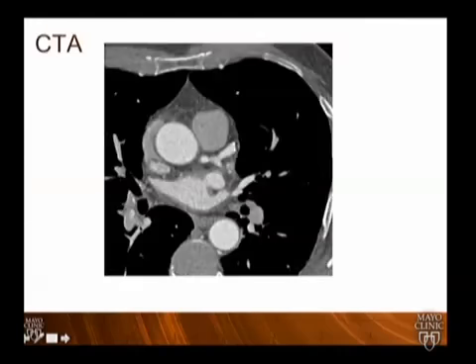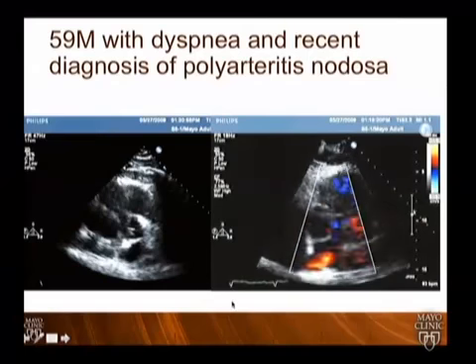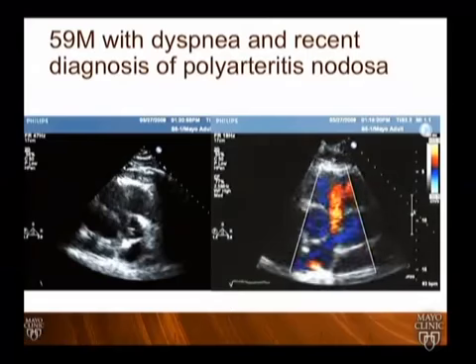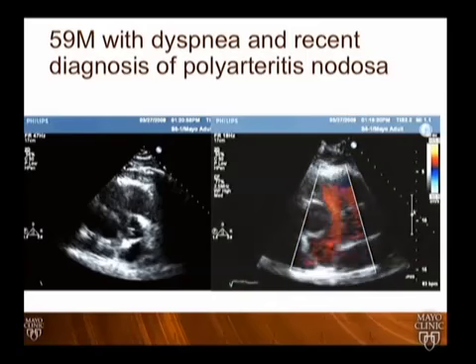In the color flow, do you think there was a little flow in there? If you go back, a little bit. I think probably we could have turned the scale down. Right, that was going to be the point. I think there might be flow right there. And if you see something like this, the two things you could do is, number one, just turn your color scale down to a lower rate, and you may bring out that color flow because it's going to be a little lower velocity than the flow that's in the ventricular chamber. And the second thing would be to possibly give contrast.